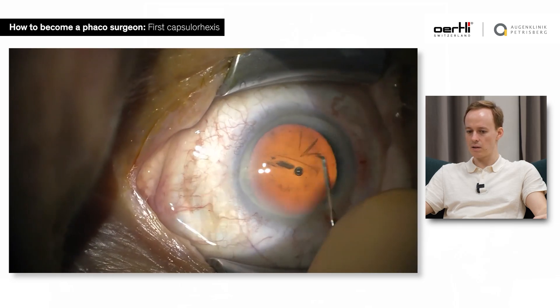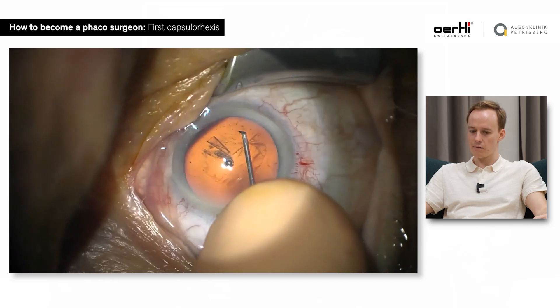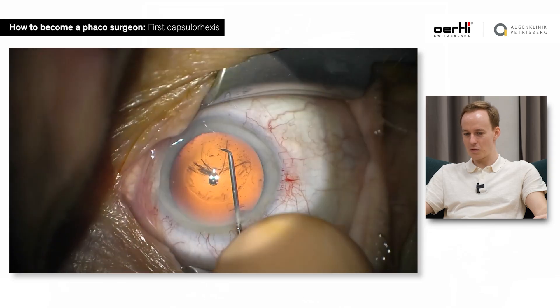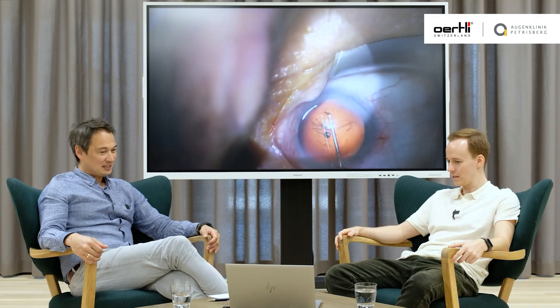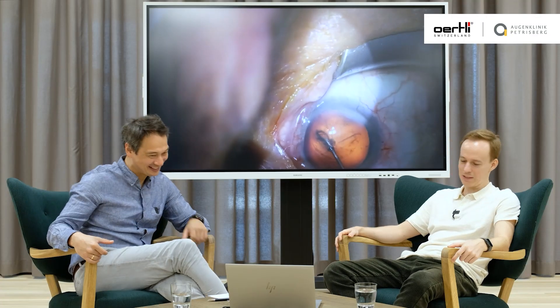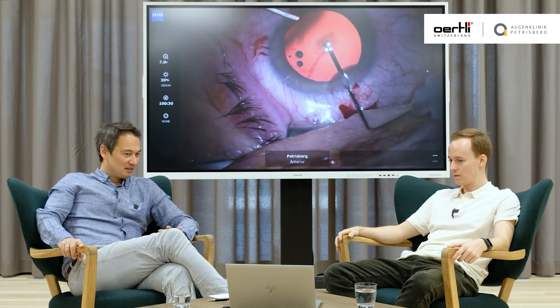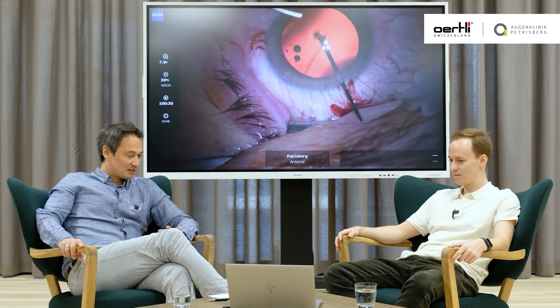This is really my first cases — you see it's really fast-forwarded, you can see my finger there. I'm not sure what I'm trying to do there, it's running out a bit, the eye is moving. What you've seen there really well is that you're losing the center picture, but you're still kind of in focus.